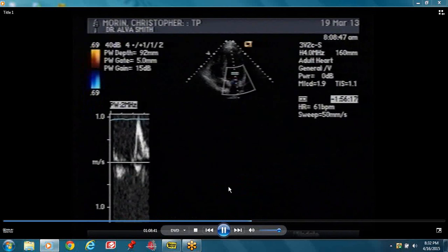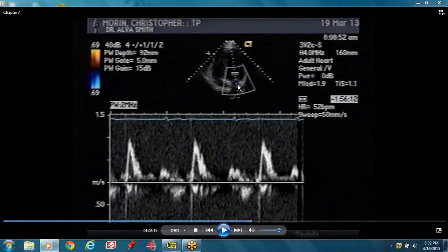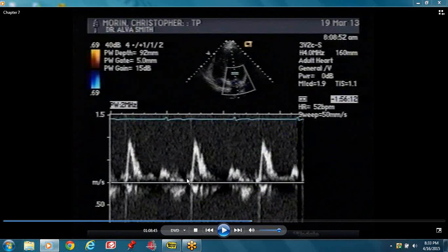We put our cursor across the mitral valve and we get what we call the mitral inflow. The cursor is across the mitral valve and the point of interest is just at the tip of the leaflet. Blood is flowing from the left atrium across the mitral valve into the left ventricle, that's why it's inscribed above the baseline because the flow is moving towards the transducer. We have our E-velocity — that's because of the suction. When the mitral valve opens, there is rapid movement of blood from the left atrium into the left ventricle, giving us this E-wave.